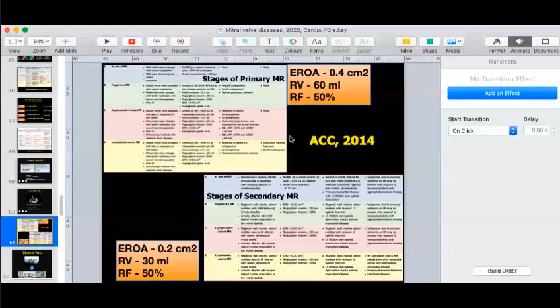Any other question? Sir, how do we set the optimum aliasing velocity for MR, sir? For MR or AR, both? You are talking about the velocity, the normal velocity. As far as validated data, the publications that were published initially were based on a velocity scale which ranged from 50 to 70 centimeters per second on the color scale. So that has been taken as the standard, and we always use that particular scale because the published data very early on used it. So 50 to 70 centimeters.